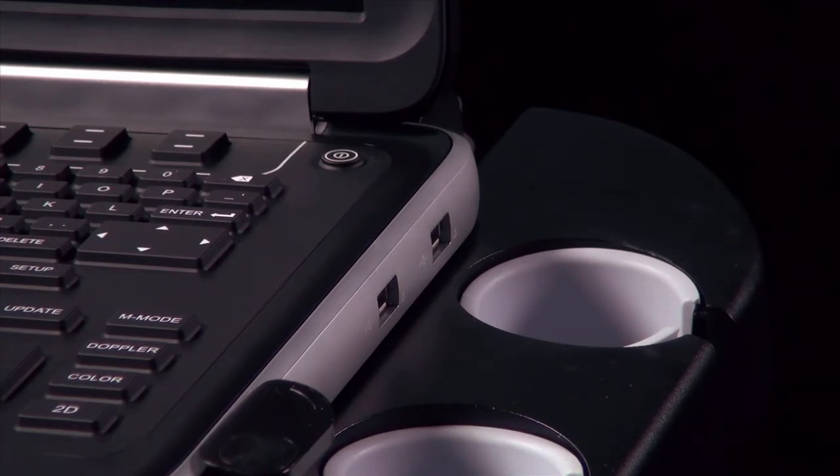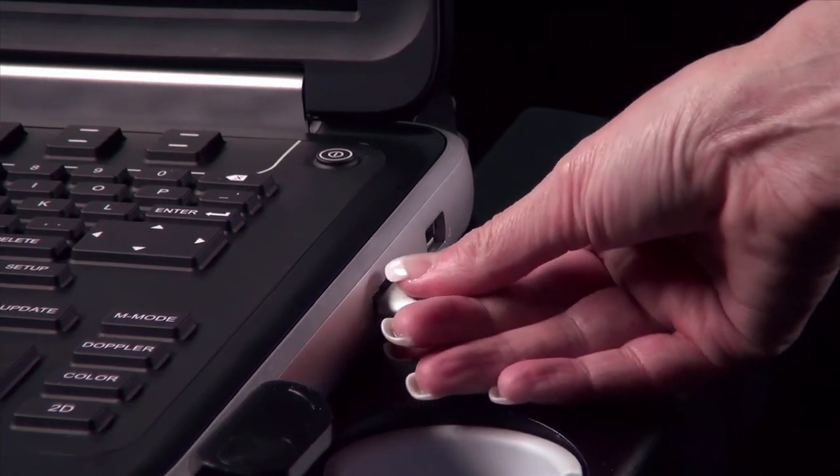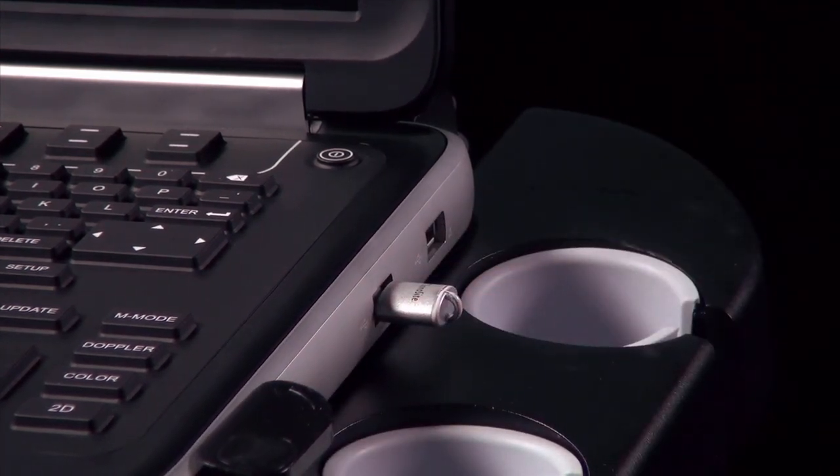On the right side of the system, there are ports for USB devices. These can be used for image storage and system software upgrades.